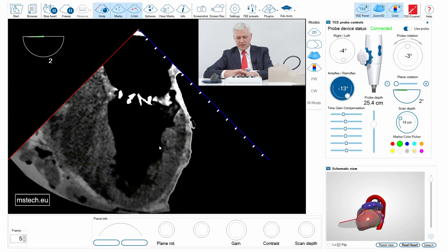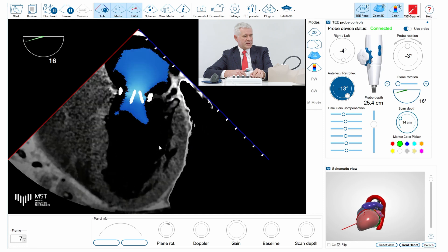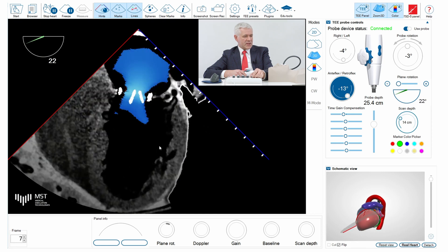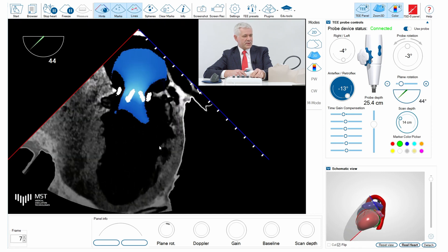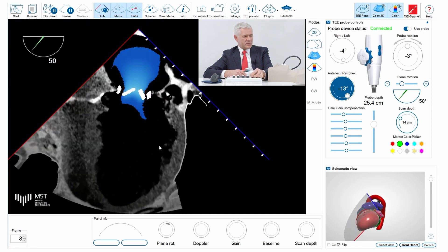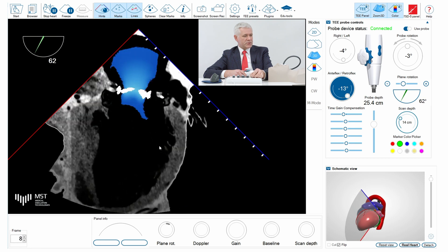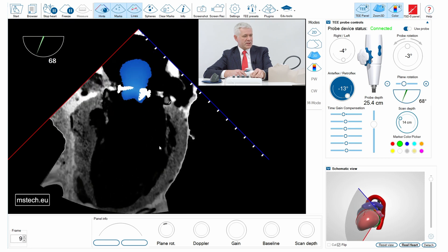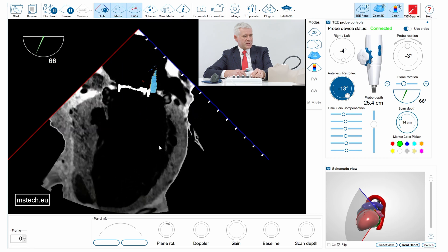Now I activate the color and we can see that there is slightly turbulent flow in the mitral prosthesis. As I rotate, we can see that there is some leak. The leak is at 64 degrees.